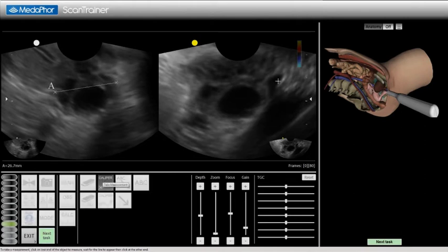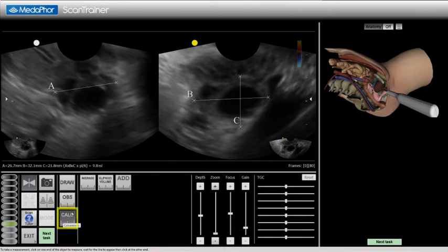Measure the left ovary in the sagittal plane. On the right half of the screen, showing the sagittal ultrasound image, I measure the maximum diameter of the left ovary in the anterior to posterior direction. I then measure the maximum diameter of the left ovary in the caudocephalic direction. I then estimate the ovarian volume. I capture an image, and then turn off the ellipsoid volume function.